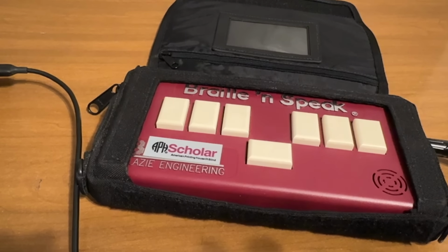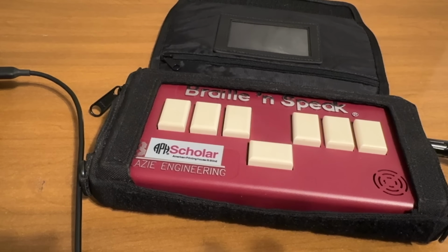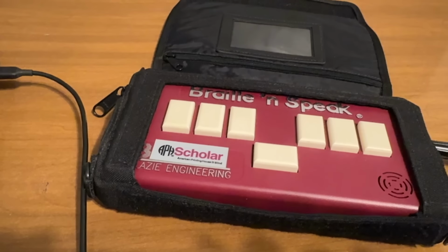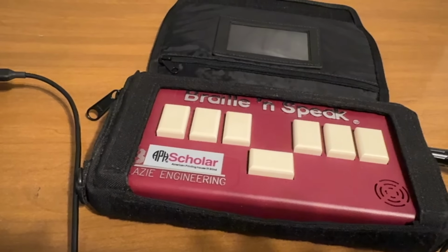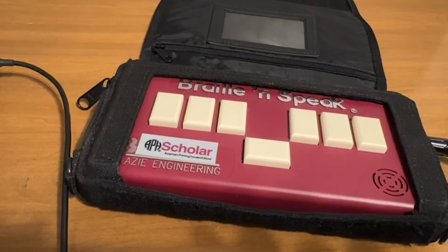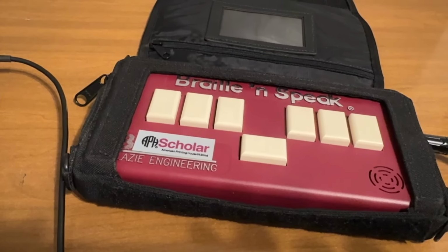Serial parameters, interactive: G, Y and serial port, F, Y and baud rate, B. 15 equals 150, 30 equals 300, 6 equals 600, 12 equals 1200, 2 equals 2400, 4 equals 4800, 9 equals 9600, 19 equals 19200, 38 equals 38400. Parity, P: O equals odd, E equals even, N equals none. Duplex, D: H equals half, F equals full, N equals none. Data bits, 4-5-6: number 7 or number 8. Stop bits, S: number 1 or 2.